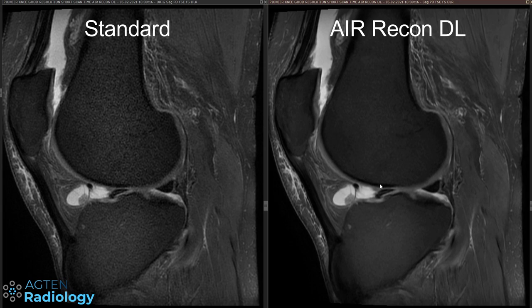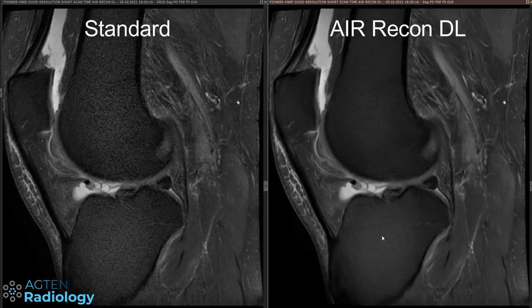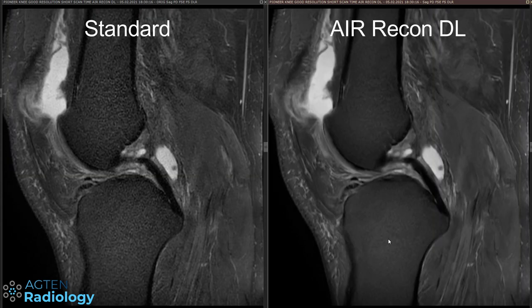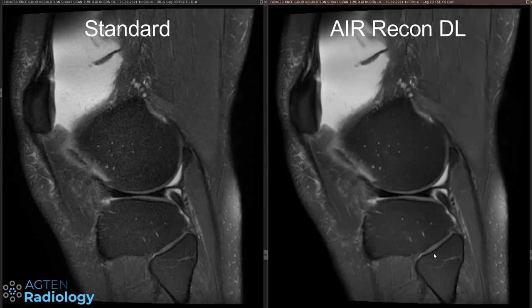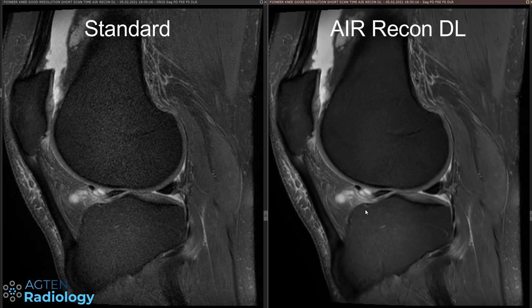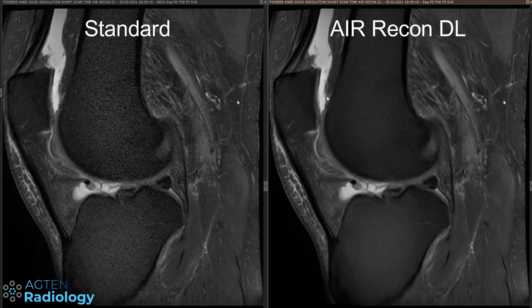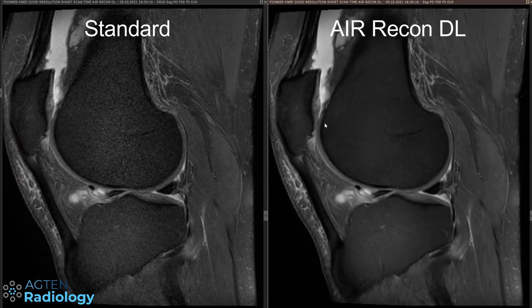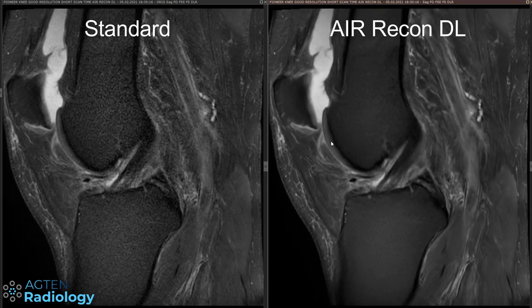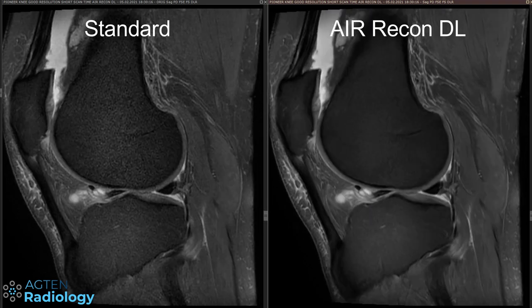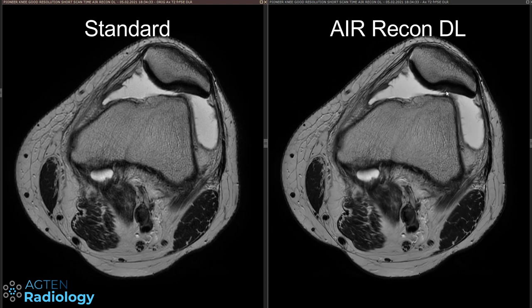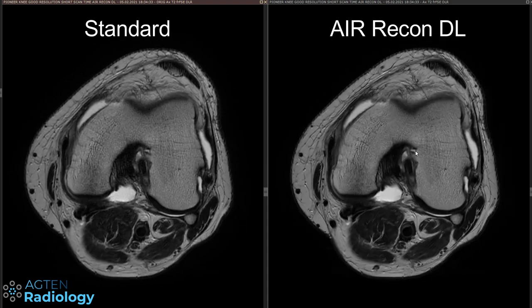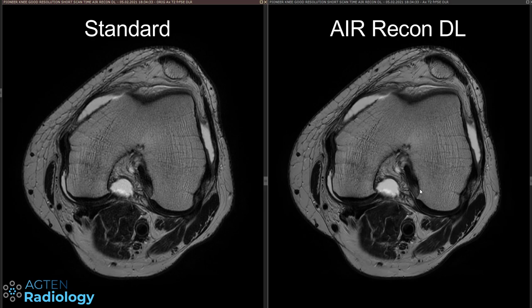Now here with the knee — even here, the image quality is so much better. Very sharp, cartilage looks really nice and crisp. You can easily see synovial changes and also cartilage fibrillations and fissures — really nice. The tendon looks super great. On the axial T2, we can see cartilage fissures and ganglion cysts.